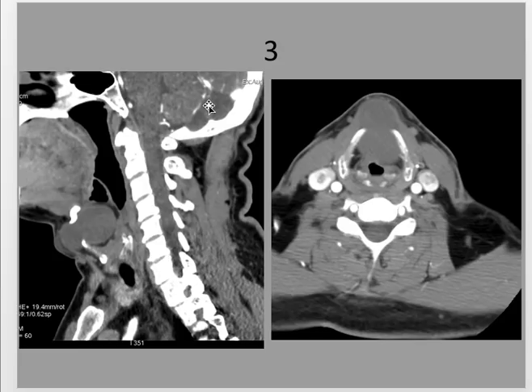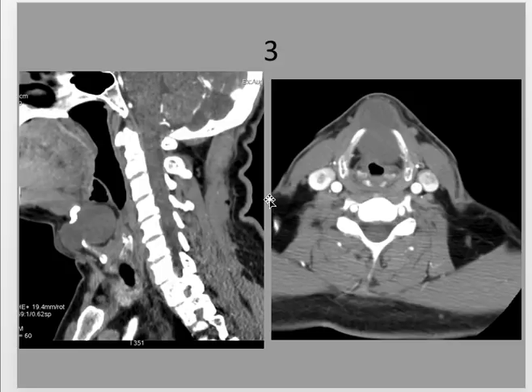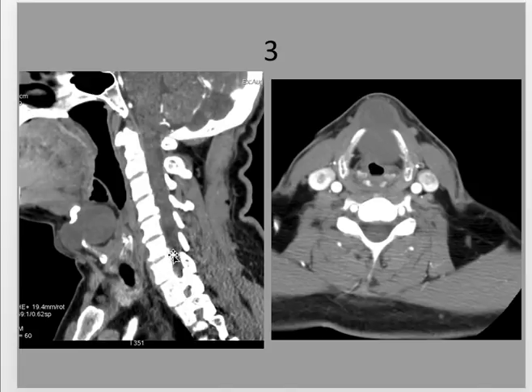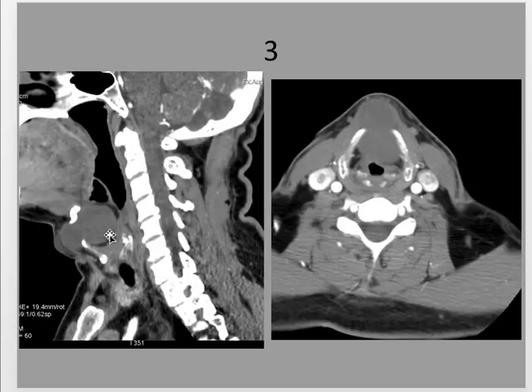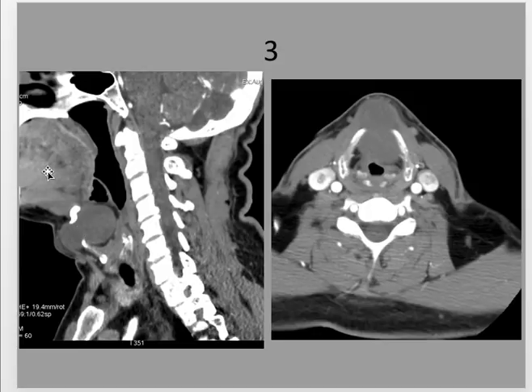The next case: what are these images? This is a sagittal CT section — a sagittal slice of the neck — and this is the axial CT taken at the level of the hyoid bone, just below the hyoid bone. What is the abnormality? Have a look at the normal structures: this is the tongue, this is the spine, vertebrae, spinal cord, and the posterior soft tissue. The subcutaneous fat is dark in appearance. You can see a fluid density structure — this is not soft tissue density. Soft tissue is a little brighter, whereas the fluid density is slightly less than the adjacent soft tissue. Always compare the density of the lesion with adjacent soft tissues.